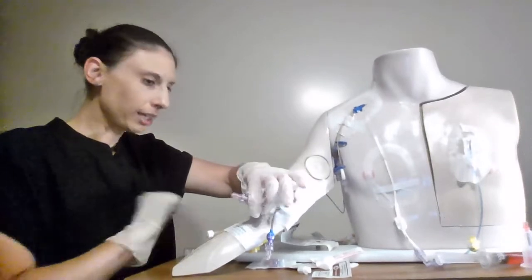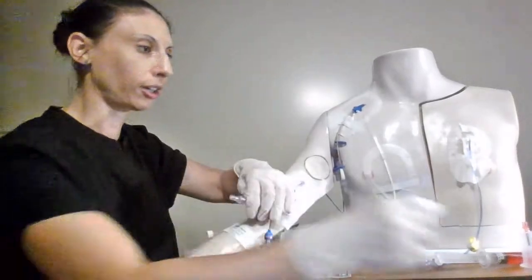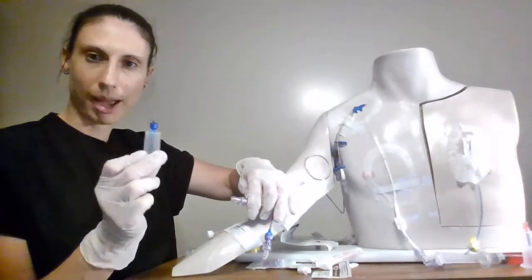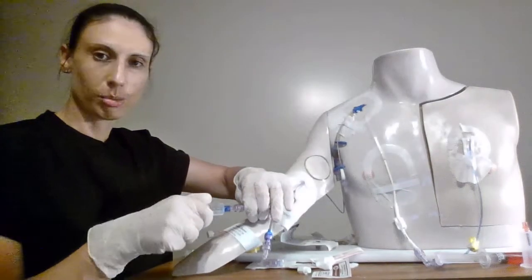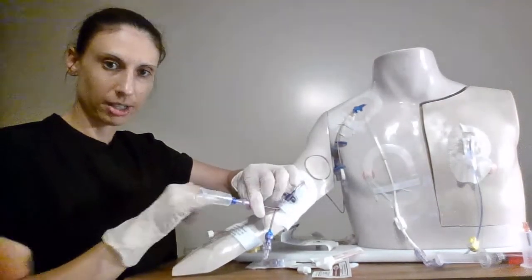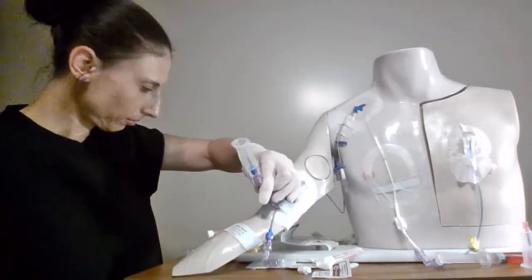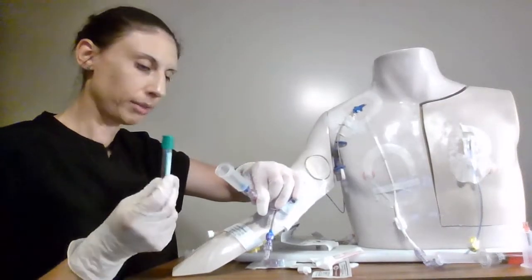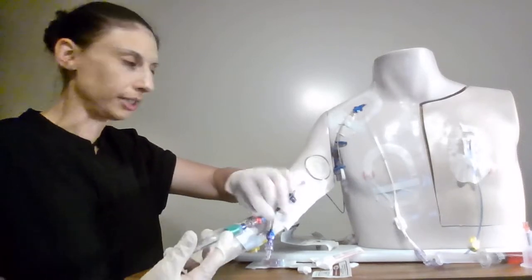So now if I'm taking lab work there's two options I can use a syringe method or I can use a vacutainer. So if I'm using a vacutainer I use the blue top one it would come in a package this would be sterile at the top. I can attach it right to my catheter the interlink cap and I would take my blood tube, whichever blood tube for whatever blood work I need and I can attach it right into the line.